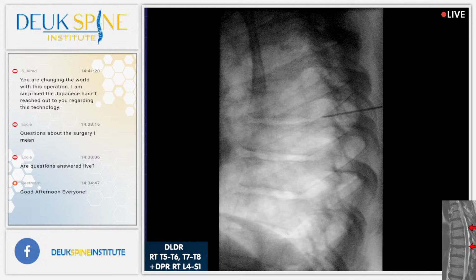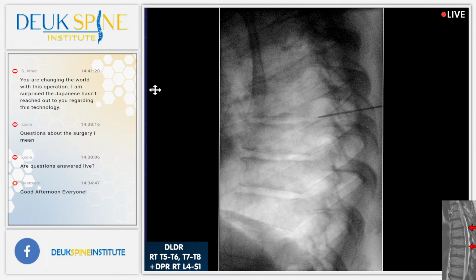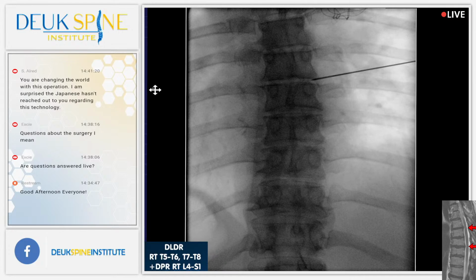Now we're around the facet. You doing all right? Give me an AP. I can't hear her. You've got to tell me what she's saying. She said she's still fine. Good. Everything's going well right now for you. Henry, do you have a good view of the MRI? Yes, we do. It looks really good right there. It looks really good on the AP.